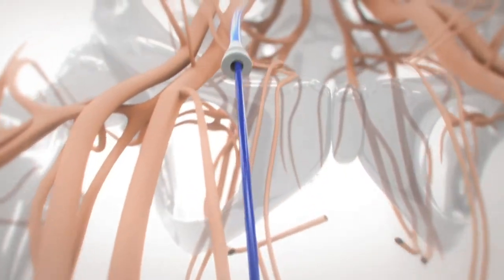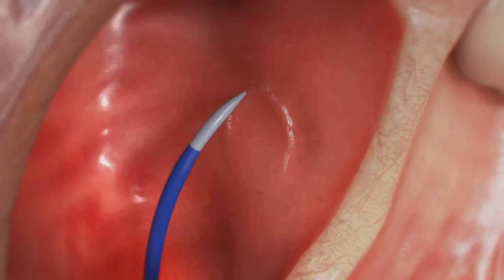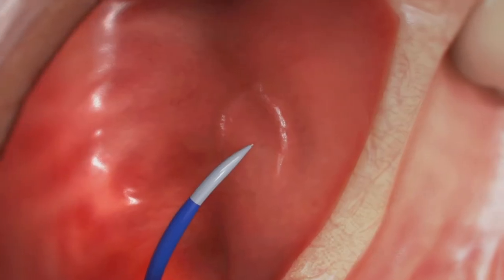To perform the implant, the physician accesses the patient's femoral vein using a standard transseptal access system with a puncture needle, crosses the septum to reach the left side of the heart.